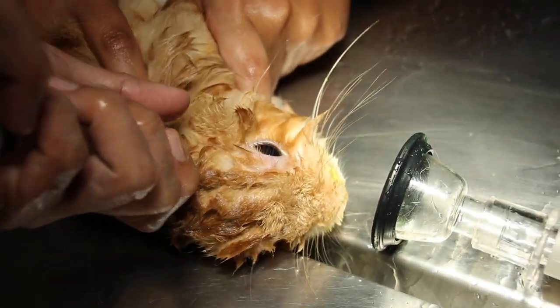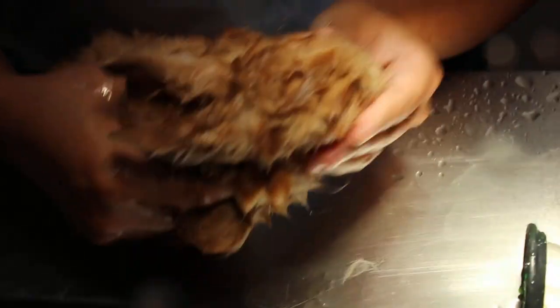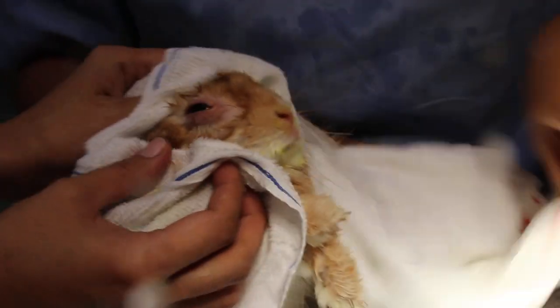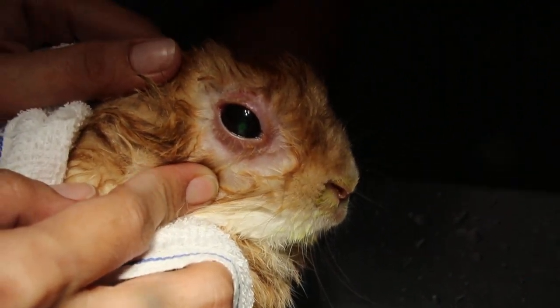The rabbit won't die from the anesthetic. Okay, that's the end of checking the eyes. We confirm that there is an ulcer on the right-hand side but it's quite low down. In fact it's easy to miss — there's no ulcer because it's so far down. Now bring it near to the lights — now we can see the ulcer. It's not a small one, it's quite a big one.